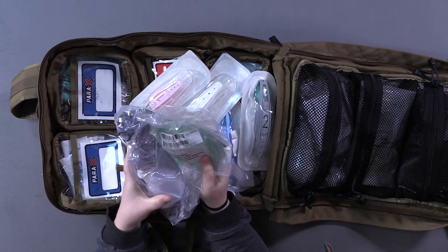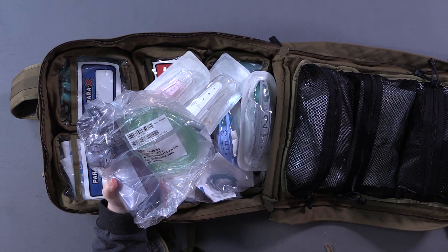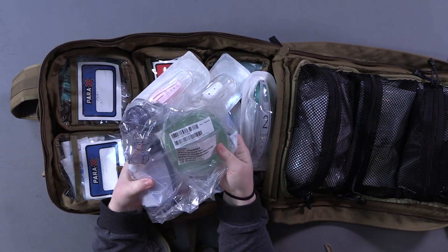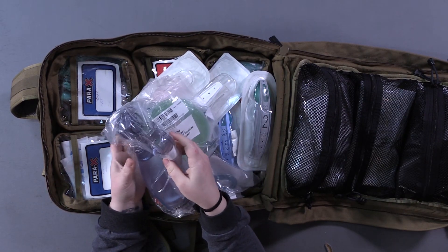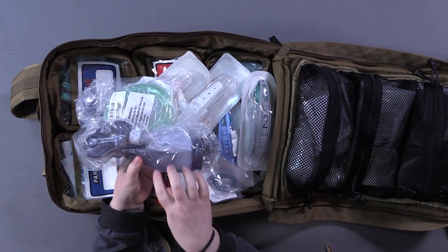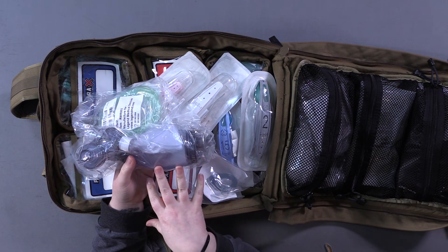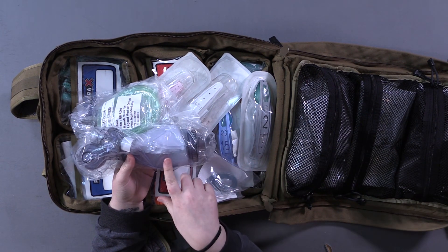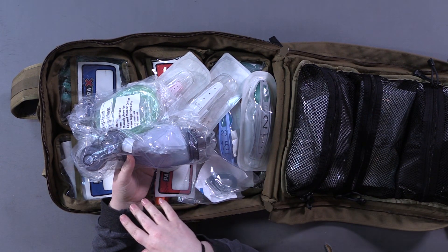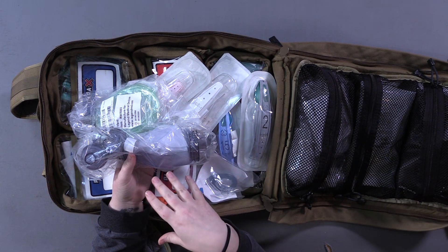In this pocket we've got the pediatric ambu bag and tubing. We also have some oxygen up here if needed. This works even without oxygen — you put the little mask on their face. The ambu bag is smaller, which is important because you don't want to over-inflate their lungs. If they're pre-pubescent you want to use the smaller ambu bag; if they've hit puberty and are young teenagers you can go up to the adult size ambu bag.